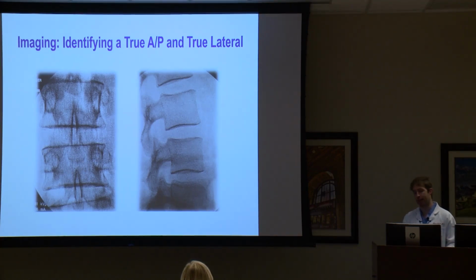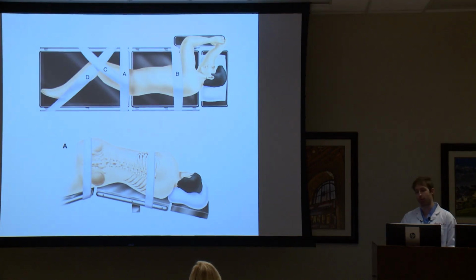And so you've got to know exactly where you are, and the pictures are your only way, because you're not going to see anything other than the x-rays. Your incision's this big. Sometimes I operate on people the size of this podium. You're trying to make things work. You've got to use the x-ray to do everything, so you might as well set the stage before you start operating, rather than turn the table away from you, turn the table back, that kind of stuff. Like I said, this is the way we tape them down.